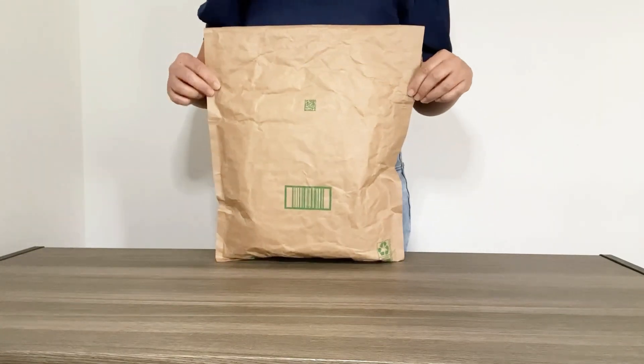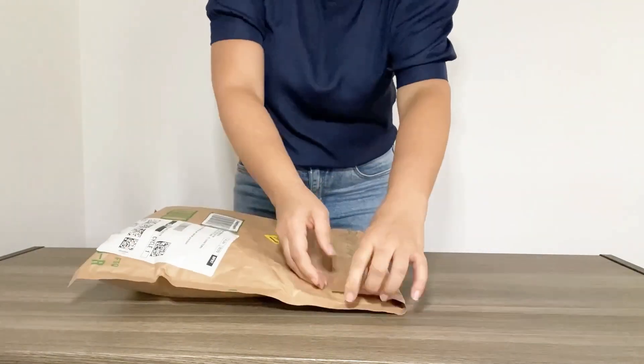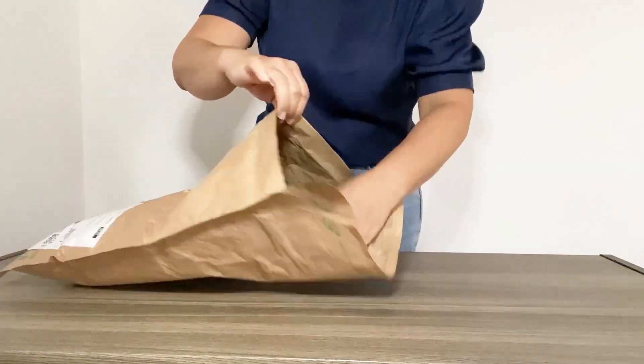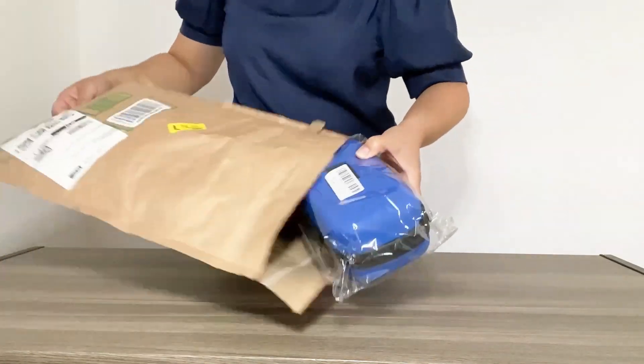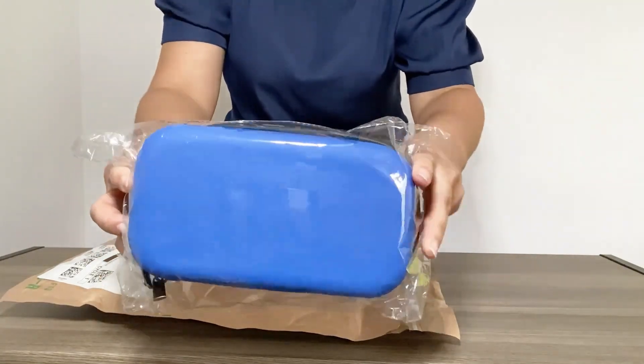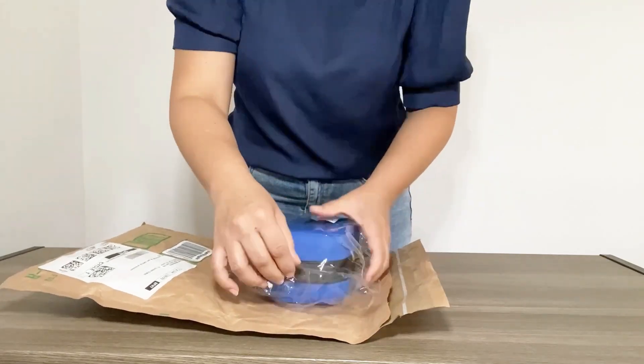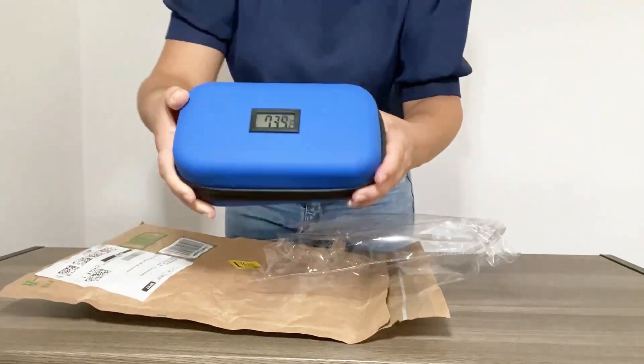Here I have this 24-hour insulin cooler travel case. It comes in nice, simple, secure packaging — well-sealed as you can see. The packing is nice and neat, so let's open it up and see what's inside.